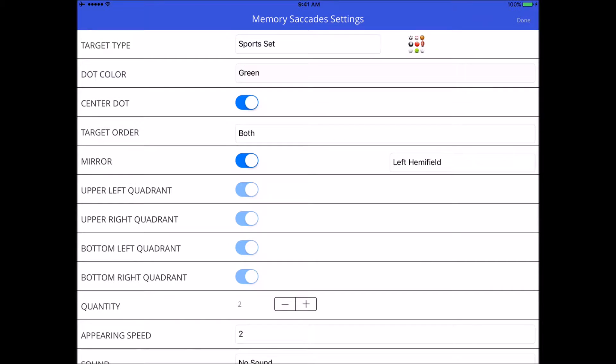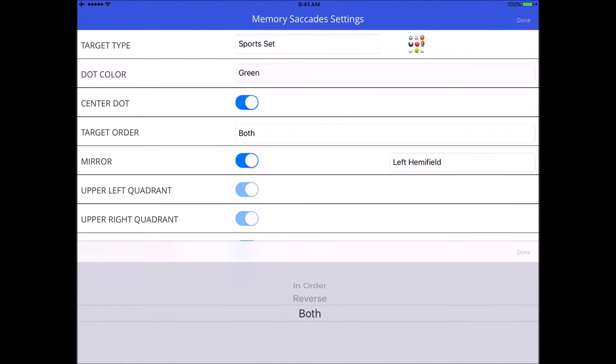Going back to settings: target order. As your targets appear, they don't appear in a particular order, but when you have to remember them — two targets will disappear and you have to remember in what order they appeared. You've got to identify exactly where the targets appeared, either in order, in reverse order, or both, depending on what you select. We'll leave it in order for now.